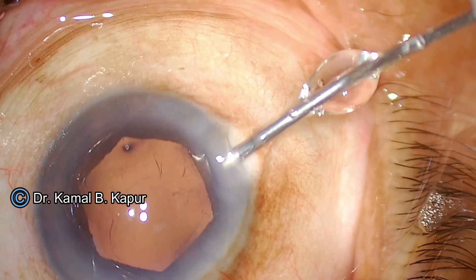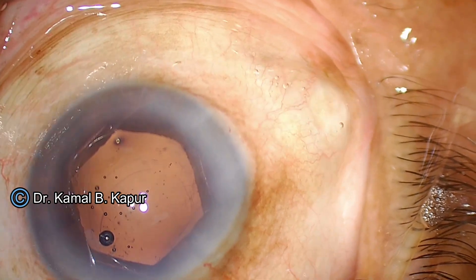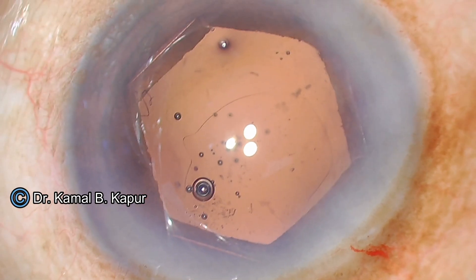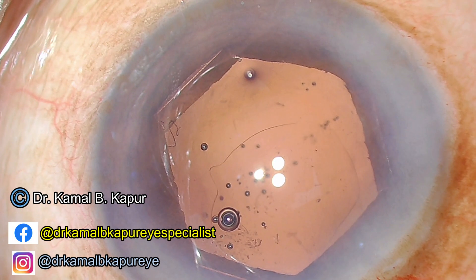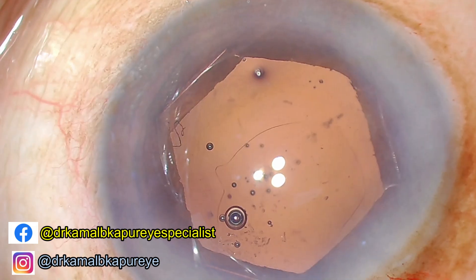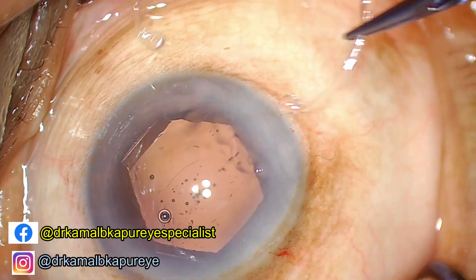Now we proceed to put viscoelastic, and as you can notice, the rhexis is eccentric and oval. We will want to correct this rhexis by creating a larger rhexis through capsuloplasty. But first things first — I would want to take care of the weak zonules by using a CTR, or capsular tension ring.